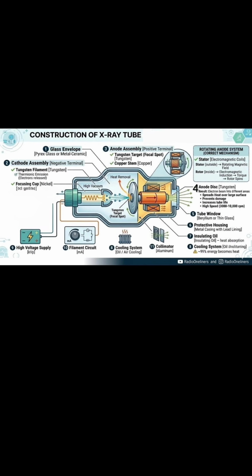Good morning, students. Here we are with a new topic, which is the construction of the X-ray tube, basically the components involved in the formation of the X-ray tube. So without wasting much time, let's start this video.